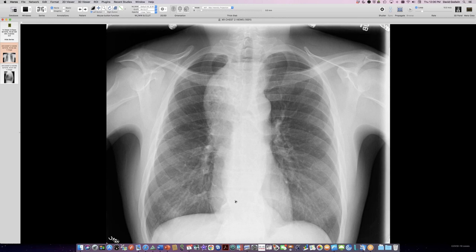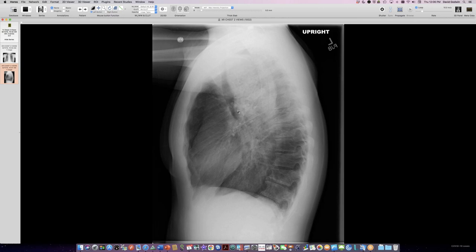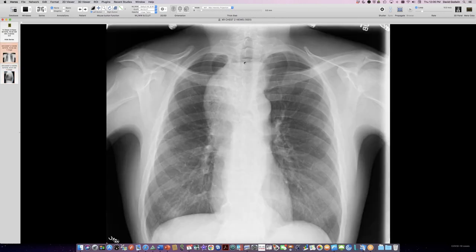Yeah, very much so. Here's a person who is examined because of trauma and has an abnormal chest radiograph with this upper mediastinal abnormality. Seems to be pretty extensive here. Abnormal contour back here, and an abnormality that goes all the way down, actually, so somewhat obscuring the back wall of the heart, but it goes all the way down. So we see an elongated abnormality like this, especially with a fluid level in it up here. Think of the possibility of achalasia.